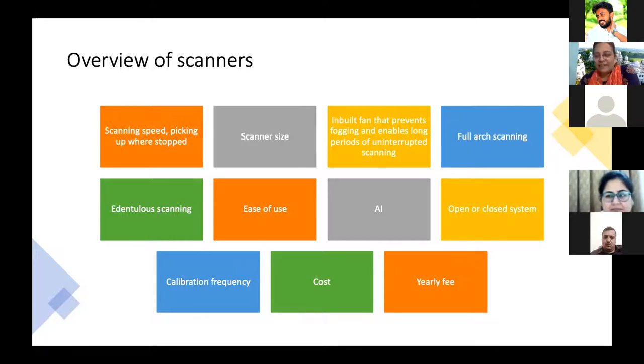Now, when we tried scanning them, our intraoral scanner was not going into the oral cavity. Then we found that was a disturbing thing. How to scan? So most of our mucor patients also could not be scanned. Otherwise, we thought we would be able to scan the palate up to the cranial, wherever the bone loss is, and digitally design an obturator. But here we failed. So there are limitations of 3D scanners.